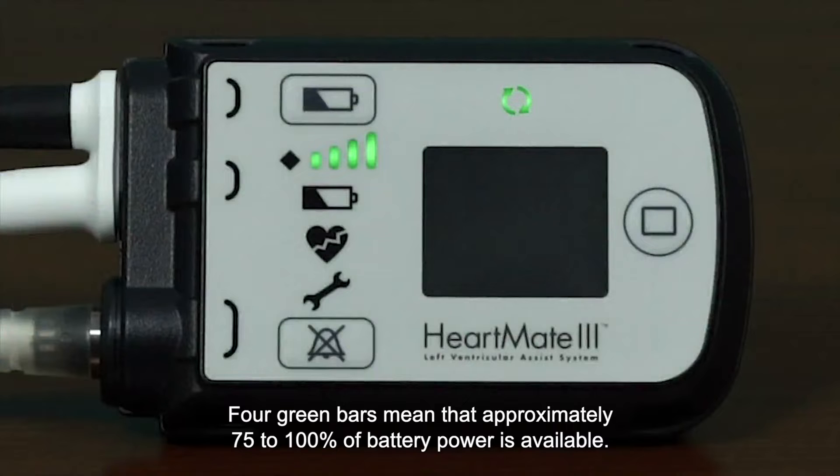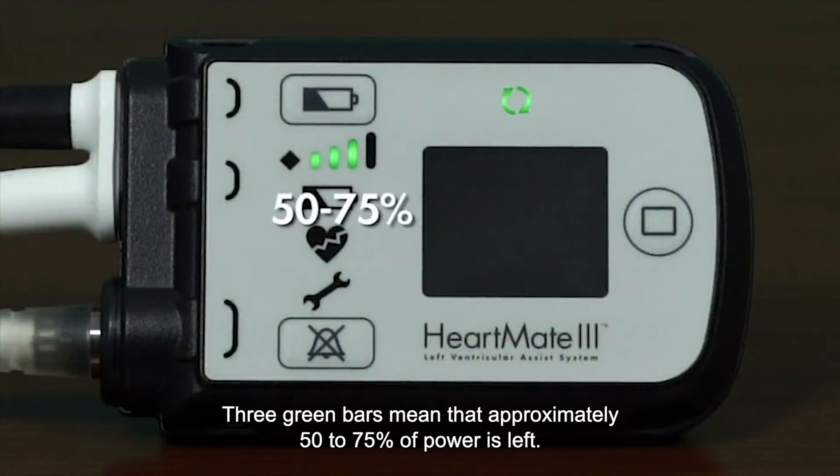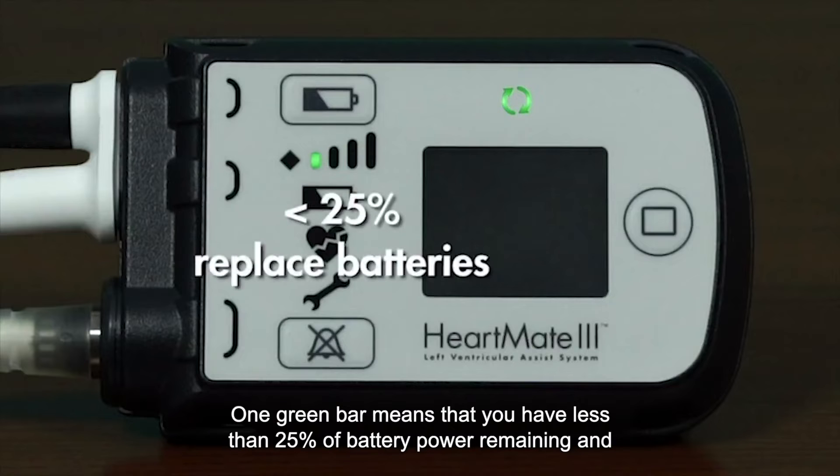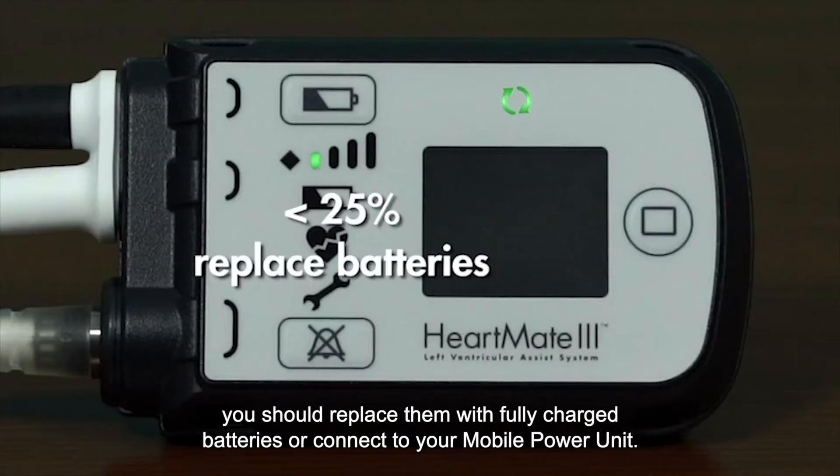Four green bars mean that approximately 75 to 100% of battery power is available. Three green bars mean that approximately 50 to 75% of power is left, while two green bars mean that approximately 25 to 50% of power remains. One green bar means that you have less than 25% of battery power remaining, and you should replace them with fully charged batteries or connect to your mobile power unit.